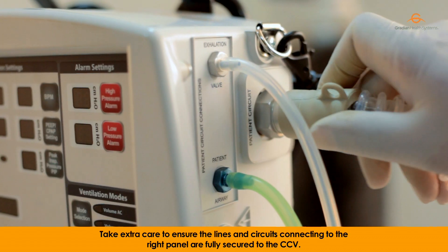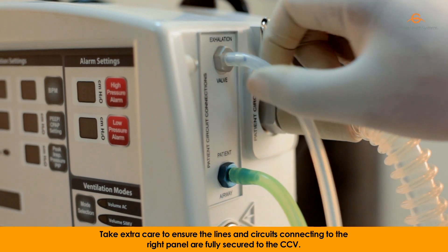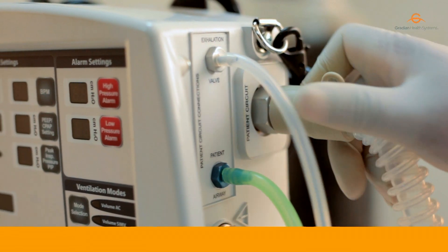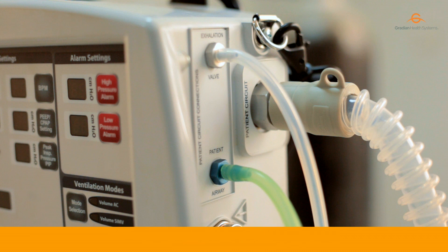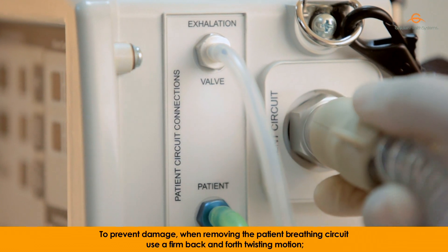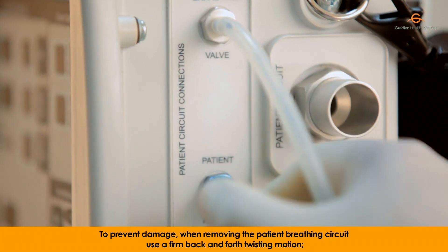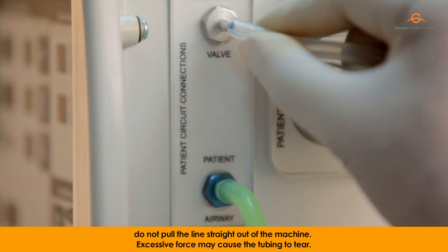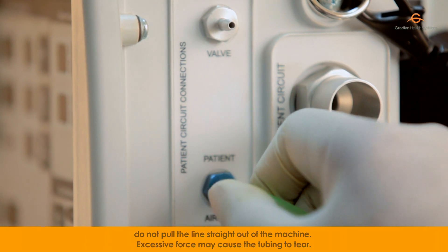Take extra care to ensure the lines and circuits connecting to the right panel are fully secured to the CCV. Once in place, gently pull on the lines to confirm they have been connected securely. To prevent damage, when removing the patient breathing circuit, use a firm back-and-forth twisting motion. Do not pull the lines straight out of the machine, as excessive force may cause the tubing to tear.